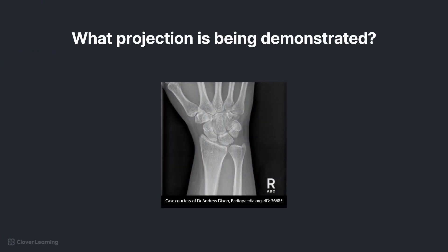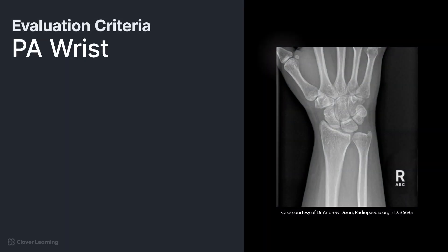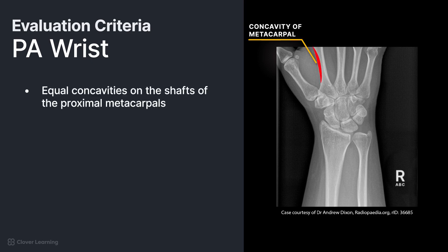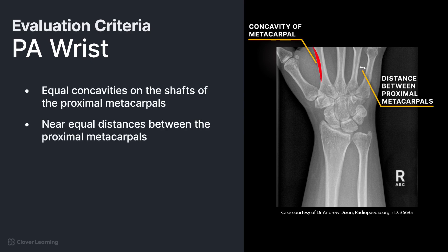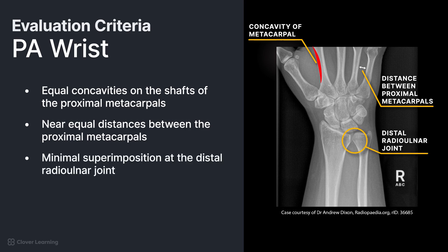Let's start with the first image. This is a PA projection of the wrist. We know this because there are equal concavities on the shafts of the proximal metacarpals, near equal distances between the proximal metacarpals, and minimal superimposition at the distal radial ulnar joint.